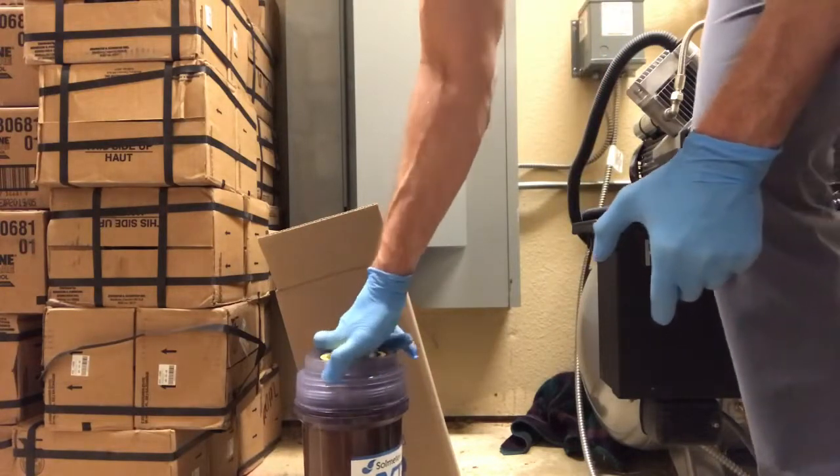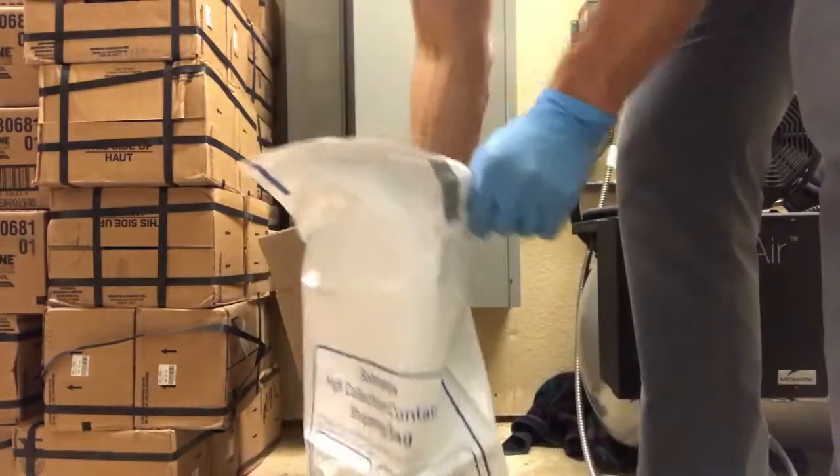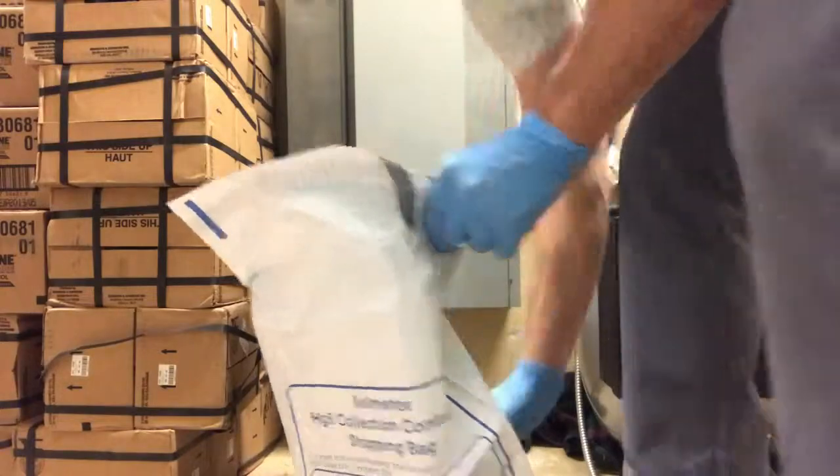You're going to use that on Solmetex's website to ship this back to them. From there, it's as simple as bagging it up, taping up the box, and shipping it back.